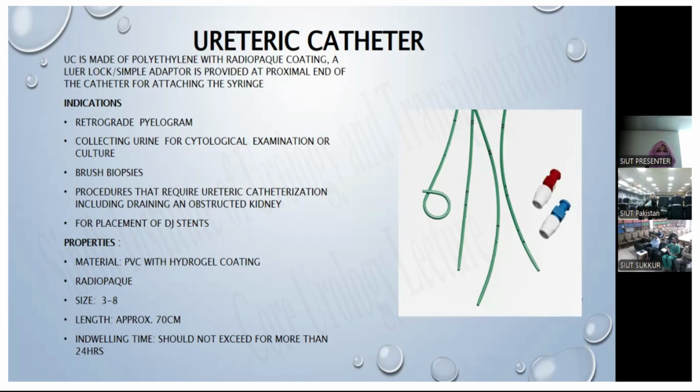Any example of any procedure in which we use ureteric catheter, like they are saying for draining an obstructive kidney, that comes to your mind? Please make it interactive, because this is a long presentation and it is going to get boring as well.